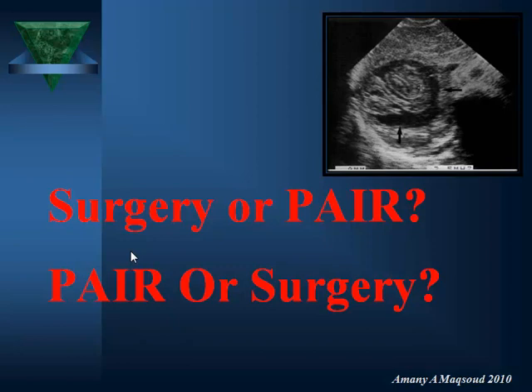Okay, I'm going to show you in every slide some of our archive about the Hydatid cyst, some of the pictures. This is also a Hydatid cyst, a mixed type of Hydatid cyst.